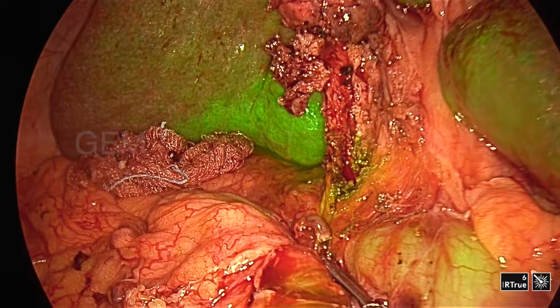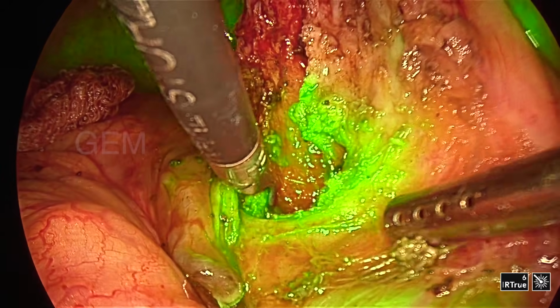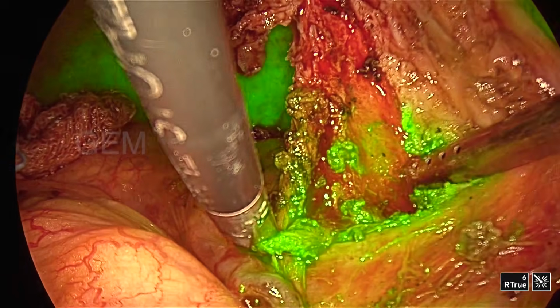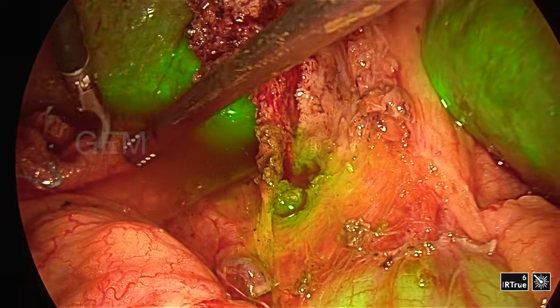This extra port will be helpful, and again you can see a lot of bile is coming out. You can see the bile in normal mode also, but this is very clear. Even one drop of bile, you can identify with this fluorescent green.